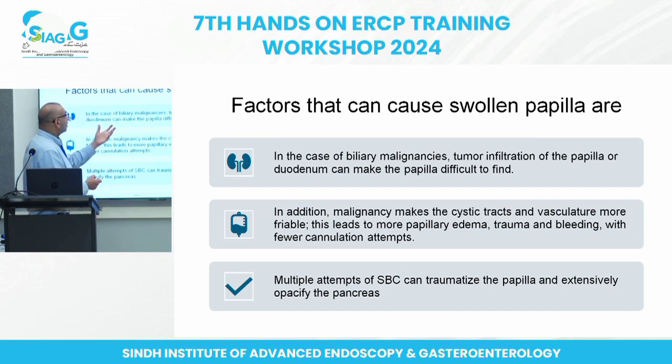हाँ, challenges में ये है कि factors that will cause swollen papillas are infiltration, tumor infiltration. That is one of the common ones. Whenever you get tumor outgrowing from the papilla, it might make it difficult for you to cannulate, लेकिन हो जाता है अक्सर, not totally contraindication.